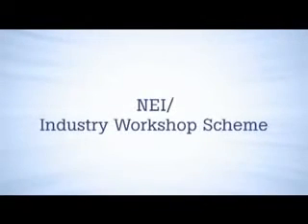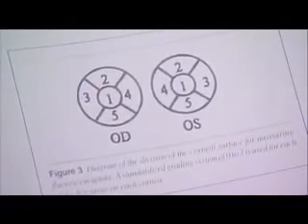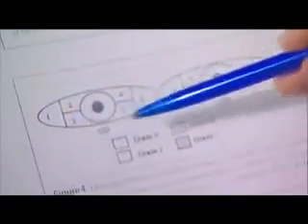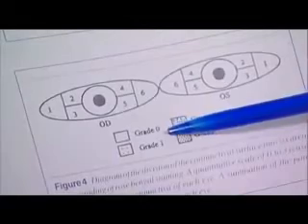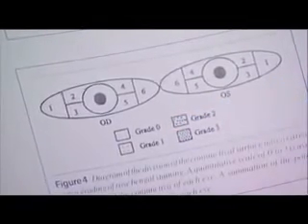The NEI Industry Workshop Scheme. In the NEI Industry Workshop Scheme, the staining grade is recorded for 5 corneal regions and 3 temporal conjunctival regions and 3 nasal conjunctival regions. The staining scale is 0 to 3 for each region, giving a maximum possible score of 33.